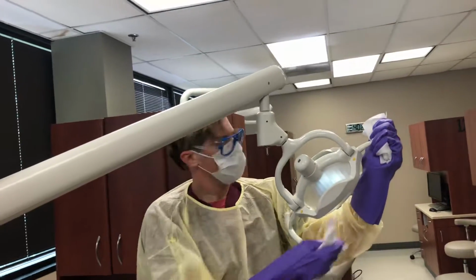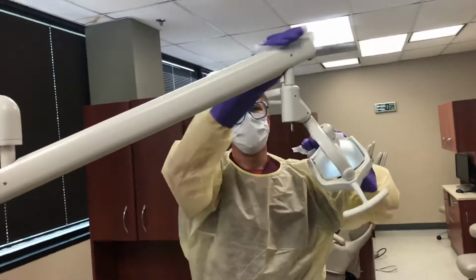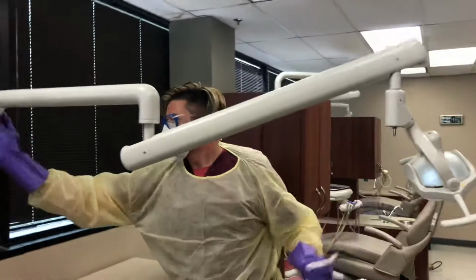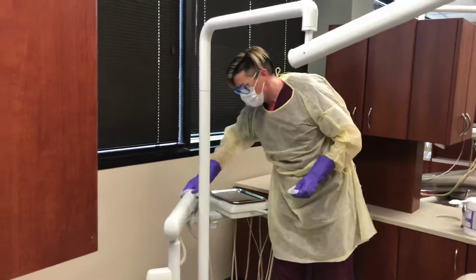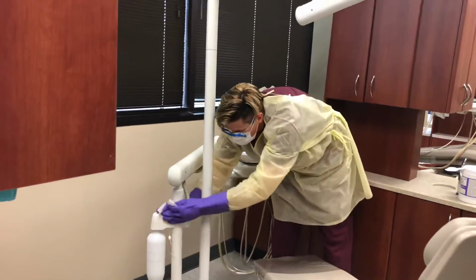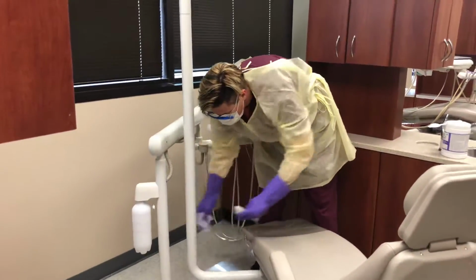So you will start at one end, like he is doing. He was telling you no, right there. You'll start at one end and work your way all the way down to the other end and then down to the floor area. Remember, we always wipe top to bottom.